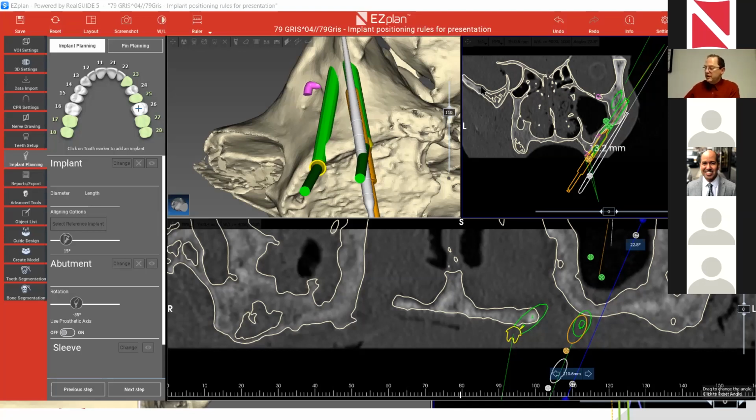For 52, what else did we do? We took the VariConnect, which is basically like a multi-unit, but it had a threaded section here, like that. On the threaded section, we put platform extenders. So actually, we can lift up the platform straight up without having any side effects. This is also a very interesting product.